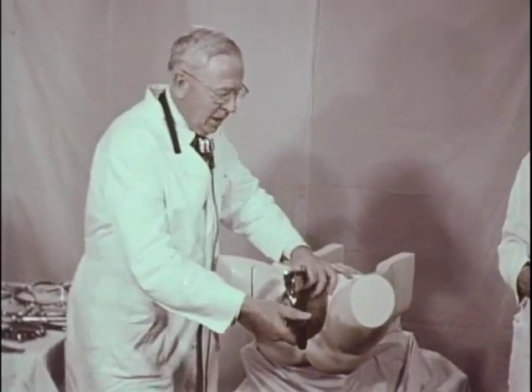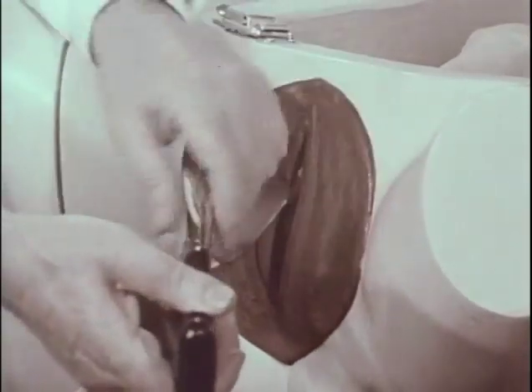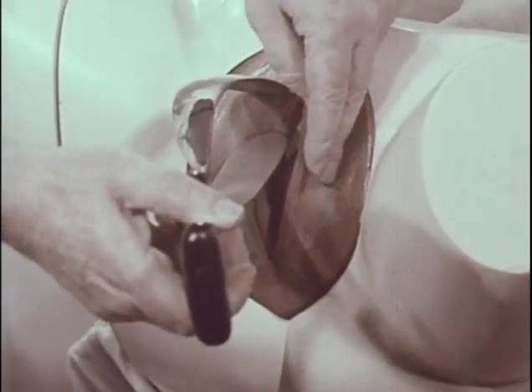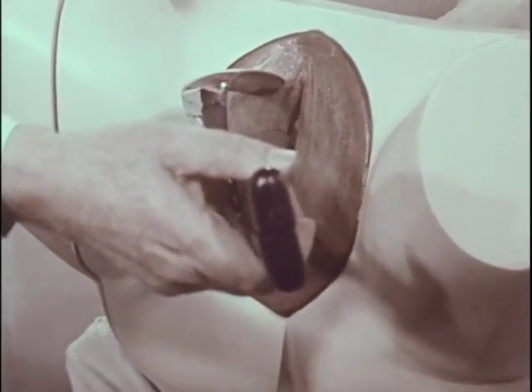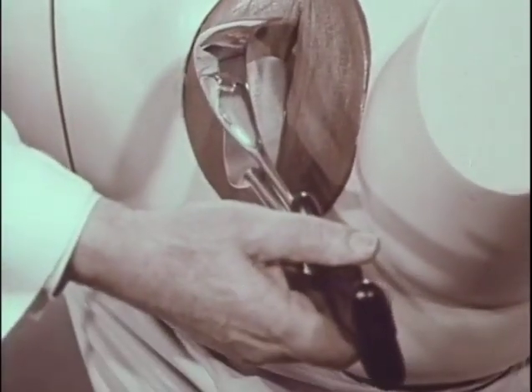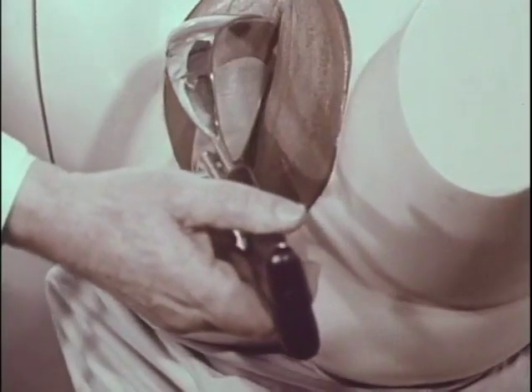The instrument is held in the position which it will be after application. And we must keep in mind that in an LOT, the posterior fontanelle is at 3 o'clock, so the anterior surface of the instrument must face in the same direction, and that the shanks must be within a finger's breadth of the posterior fontanelle in order to satisfy the first check of a good application. So, the handles, when applied, will be directed obliquely away from the long axis of the patient because of the pelvic curve.